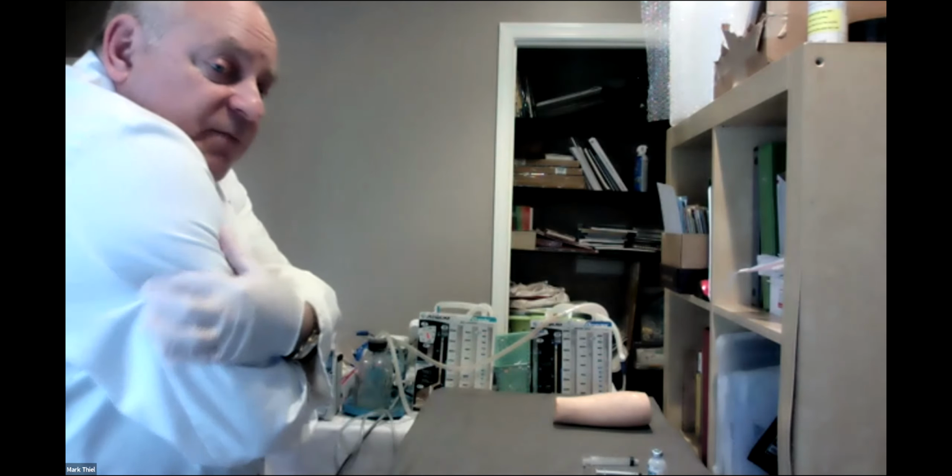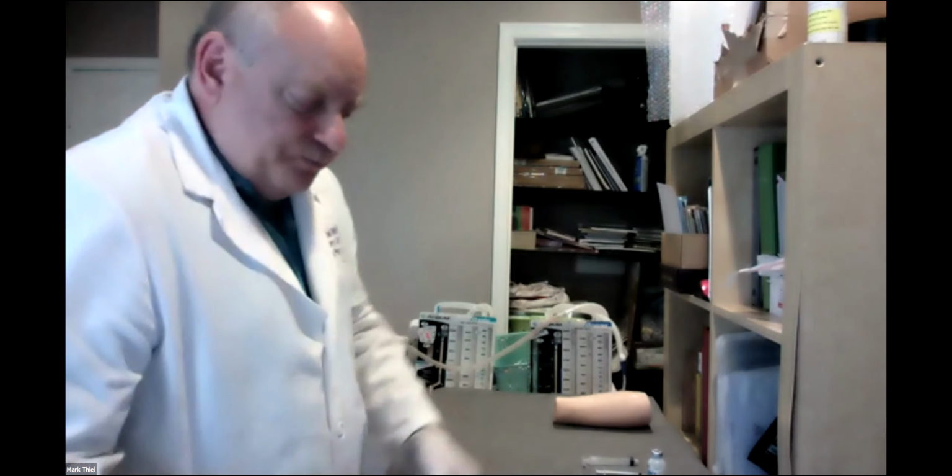The needles are tiny short, so they won't penetrate into the muscles for subcutaneous needles and injection. The other site of note is the fatty tissue on the back of the arm. Also, a common site and a good site for nurses to use when a patient is receiving multiple injections on the abdomen. Good site, easy access.